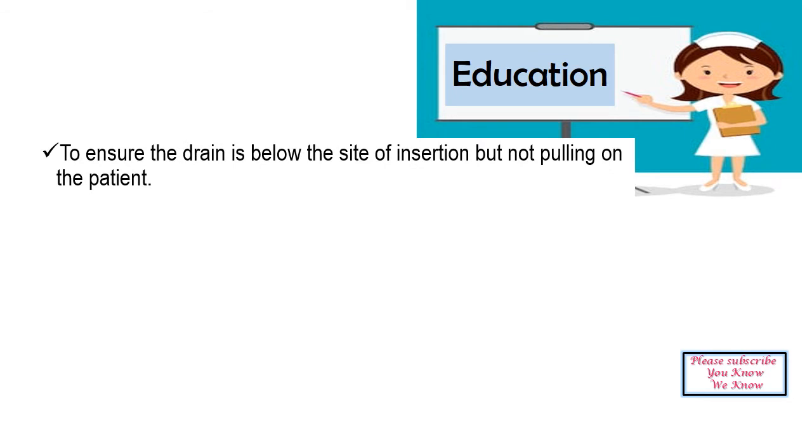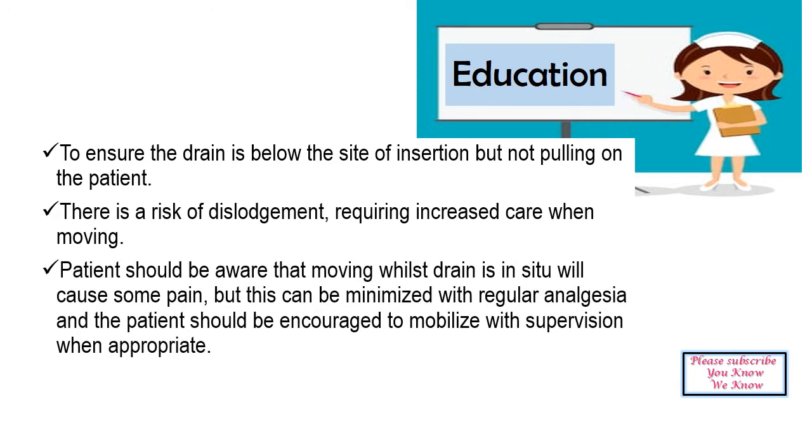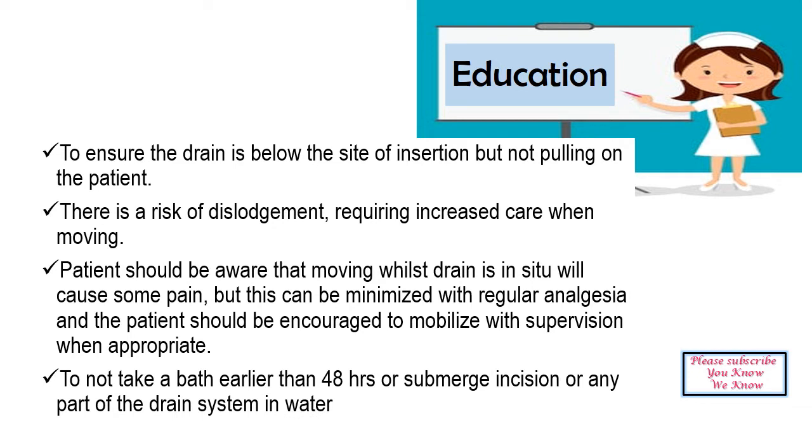Nurse-patient education. Educate the patient to ensure the drain is below the site of insertion but not pulling on the patient. There is a risk of dislodgement, requiring increased care when moving. The patient should be aware that moving whilst the drain is in situ will cause some pain, but this can be minimized with regular analgesia, and the patient should be encouraged to mobilize with supervision when appropriate. Educate the patient to not take a bath earlier than 48 hours or submerge the incision or any part of the drain system in water.